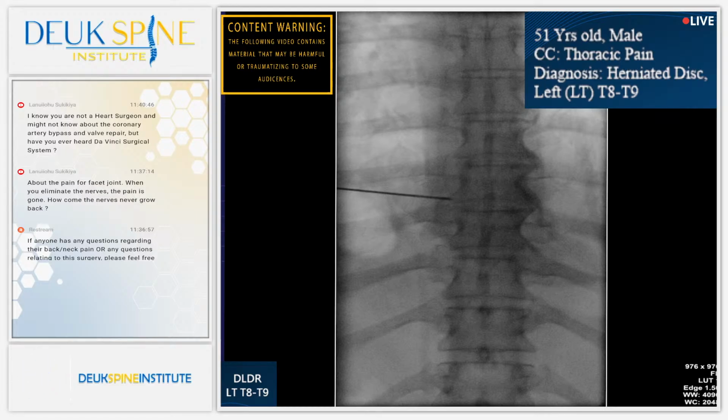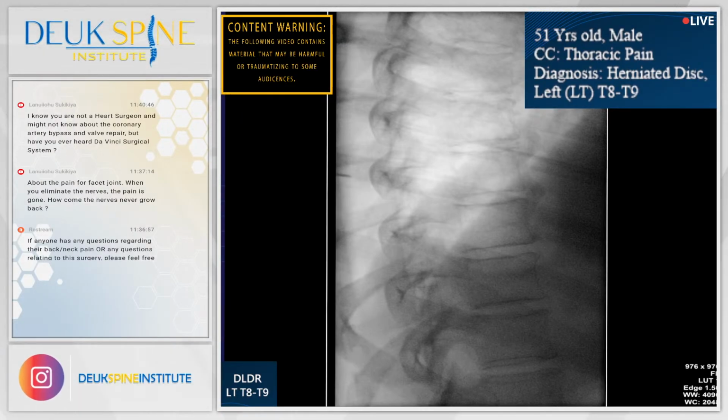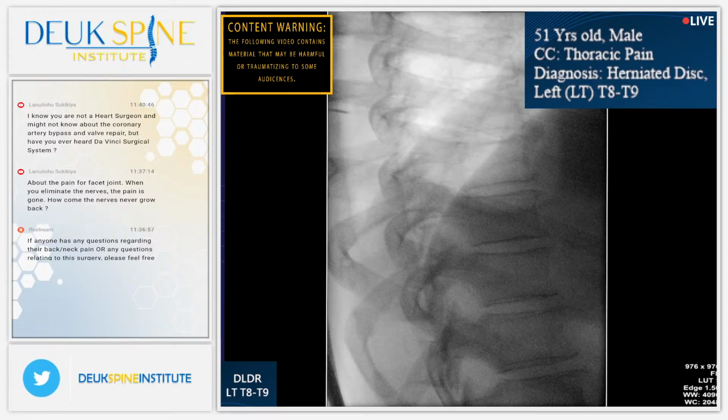Let's try again, shot. All right, 12. All right, we need to figure out where 8-9 is on this new view. So come south a little bit, shot. That's probably 12, 11, 10, 9, 8. I think that's 8-9 right there.